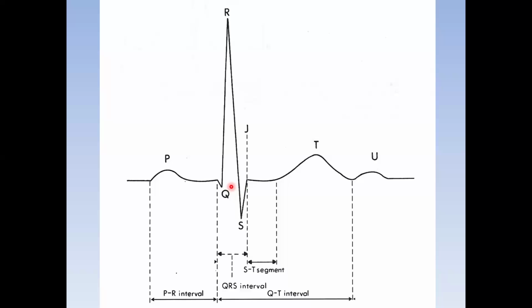So this is the ECG, well known: P wave, QRS complex, QT interval, and then this is the PR interval, from the beginning of the P wave to the beginning of the QRS complex. And that's where we're going to focus today, just this part.